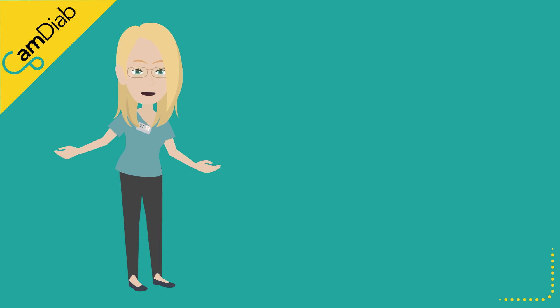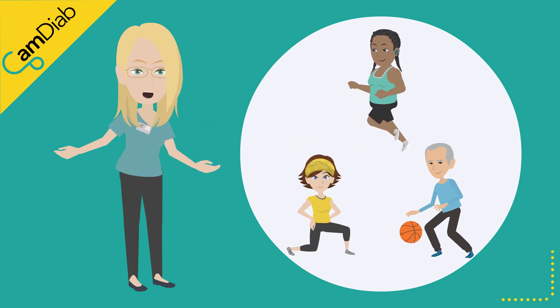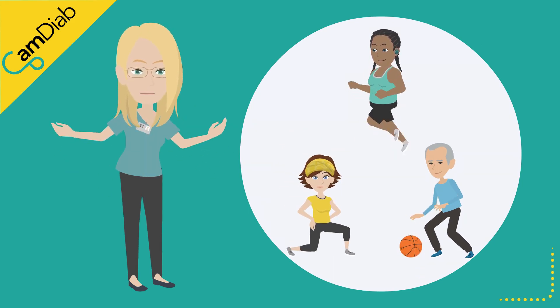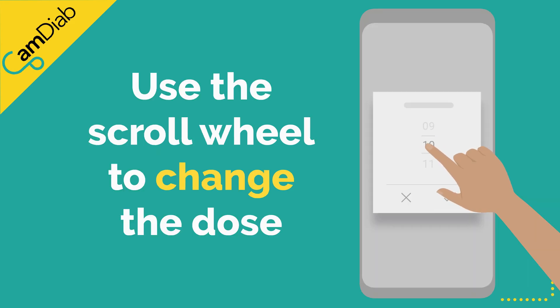Occasionally there may be times when you might like to give less insulin than suggested. For example, if you are going to be physically active immediately after eating the meal. You can tap on the suggested dose and use the scroll wheel to change the dose as appropriate.